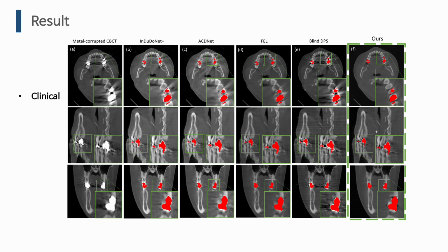And lastly, these are our clinical results. Despite being trained on a synthetic dataset, we can visually see that the metal artifact reduction works well on actual clinical data.